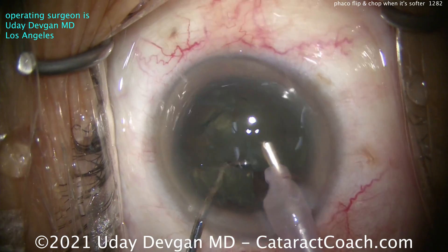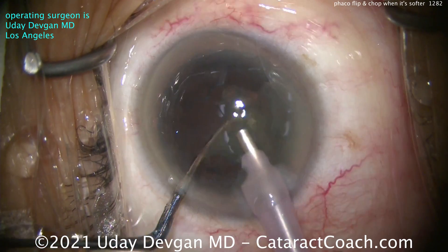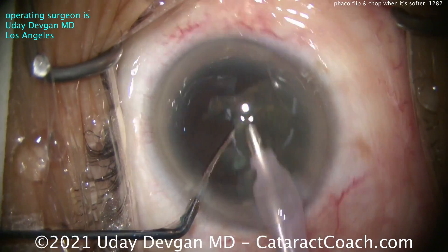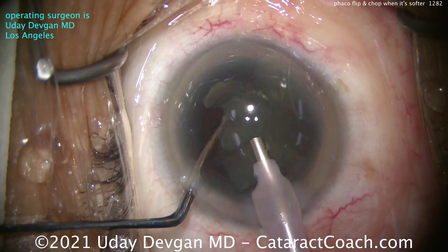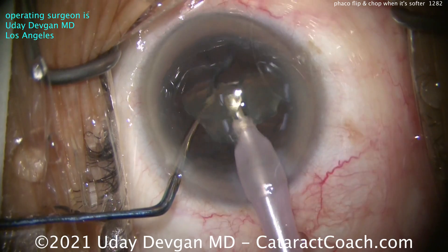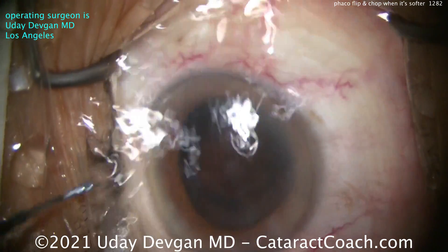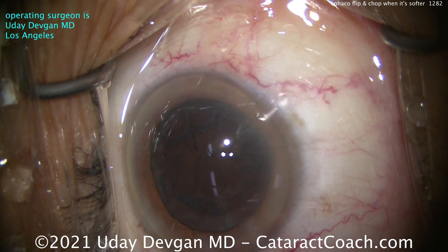We do a little bit of a chop — it didn't really do a whole lot. We're just going to feed this into the probe. The chopper goes into the same position with the high flow of 40cc per minute. Things just happen. This just goes down the port pretty easily. There's the last piece coming out. Nucleus removal was obviously a breeze in this case because there's just not that much density.